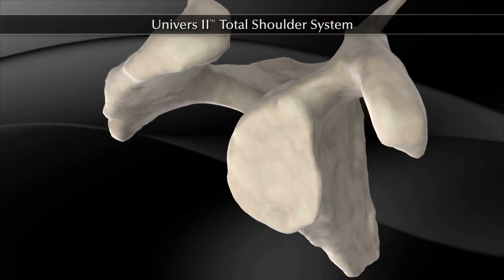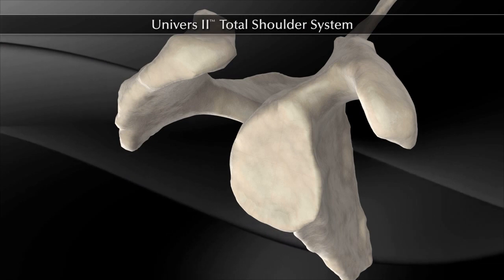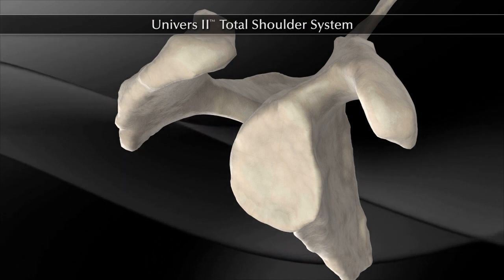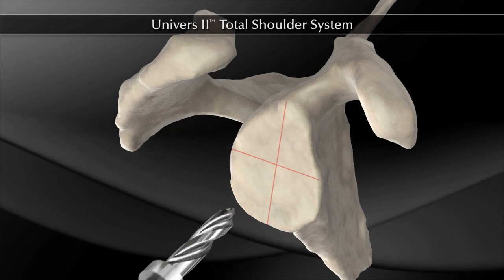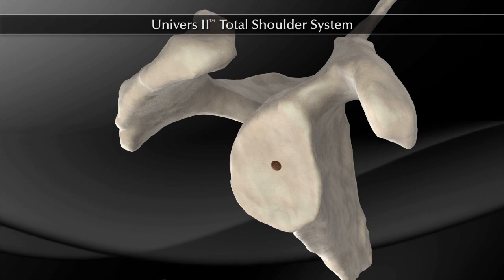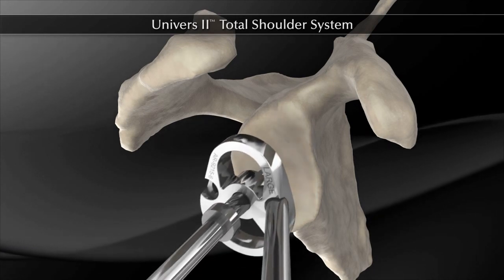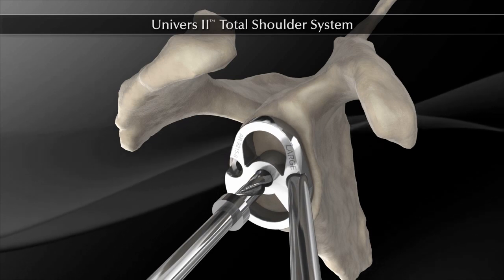The glenoid is prepared by removing cartilage and any additional soft tissue that may interfere with placement of the glenoid implant. Next, the center of the glenoid is identified and marked. A small pilot hole is created at this center point. Place the 6 mm drill through the appropriate size No. 1 drill guide and center the drill into the pilot hole.